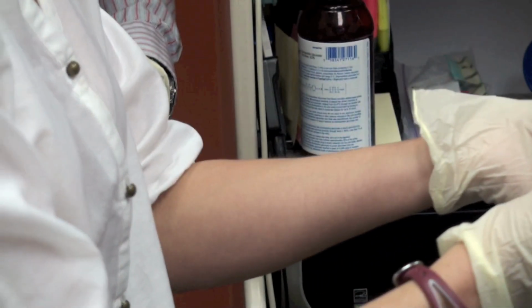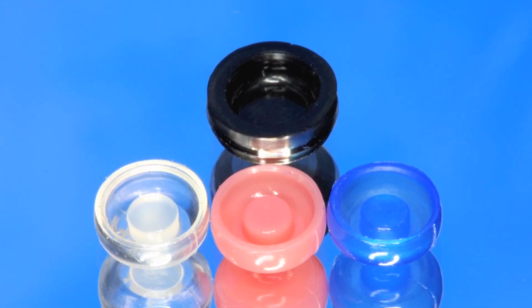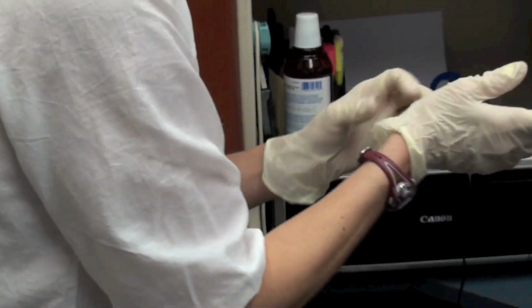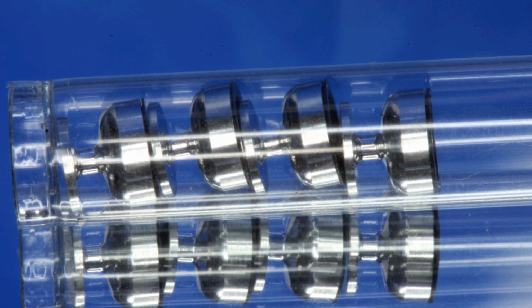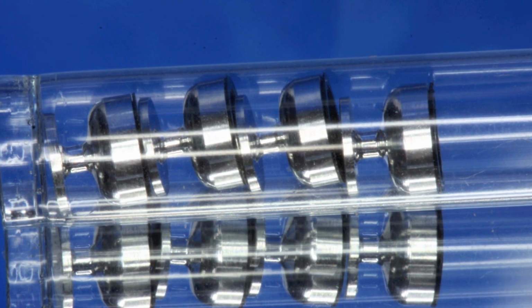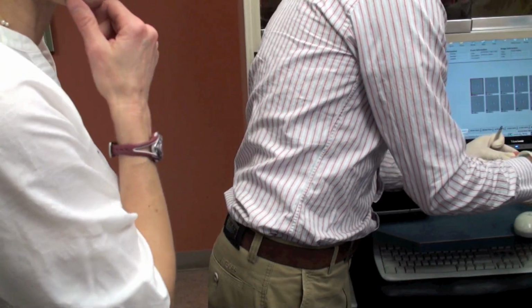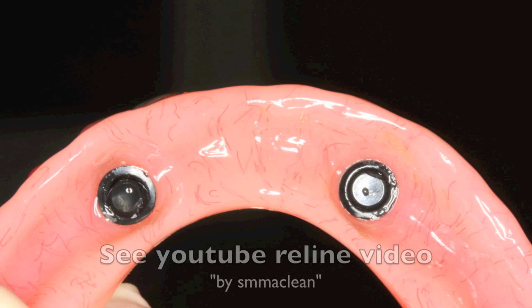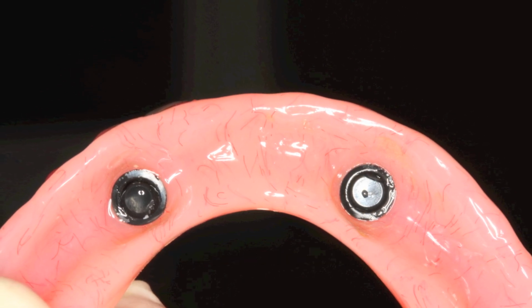Okay. In the overdenture impression I did the other day, I didn't realize those little black things could wear out inside the coping, so that's a good thing to have around too, right? Yeah. Usually you can get them in packs of 5. And Dave had said you can get them in packages. So you'll keep a bunch of these around where you have quite a few of those patients. And if you're going to do a reline, you need to put the black caps in to do your reline. We'll go over that next time.